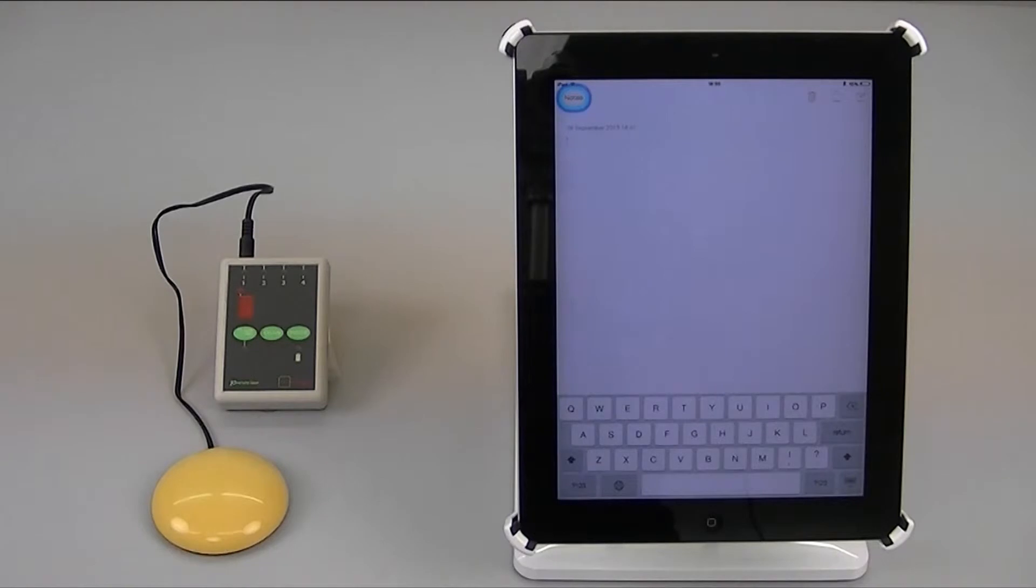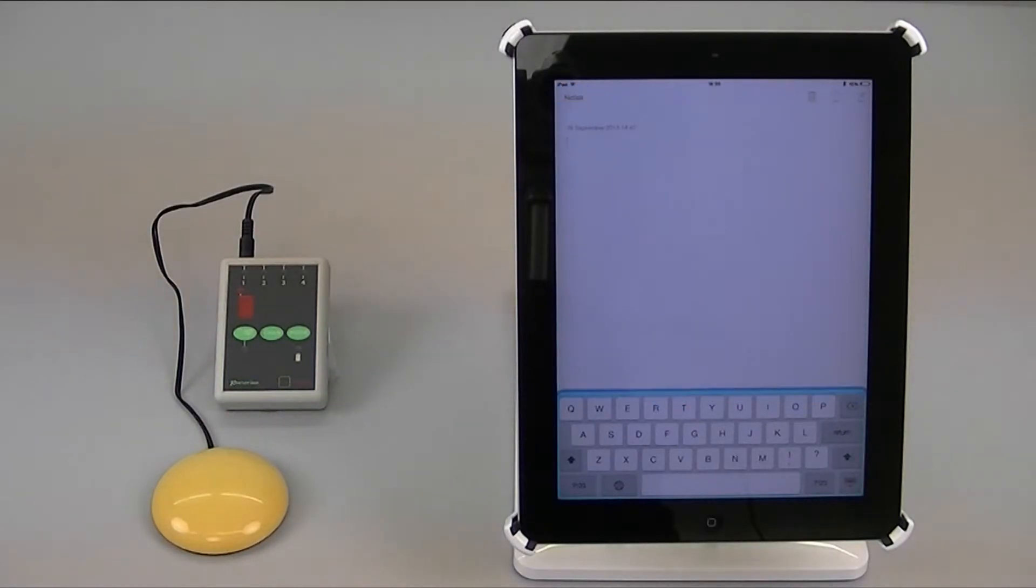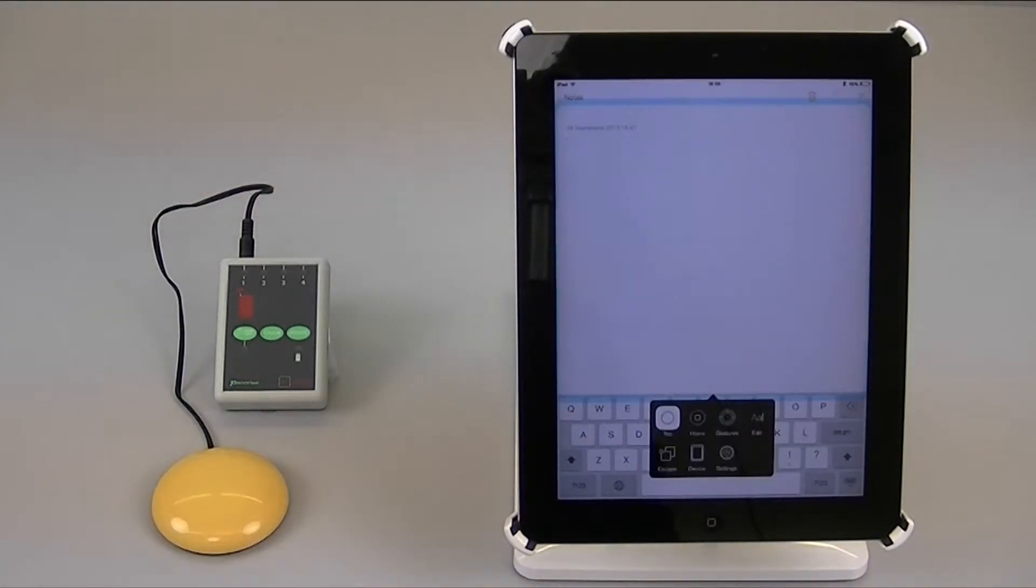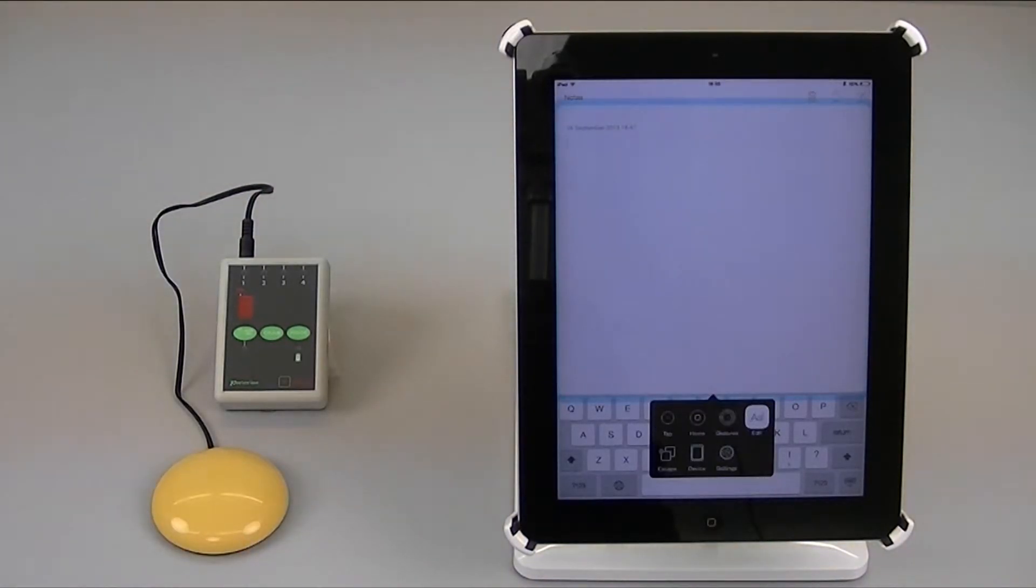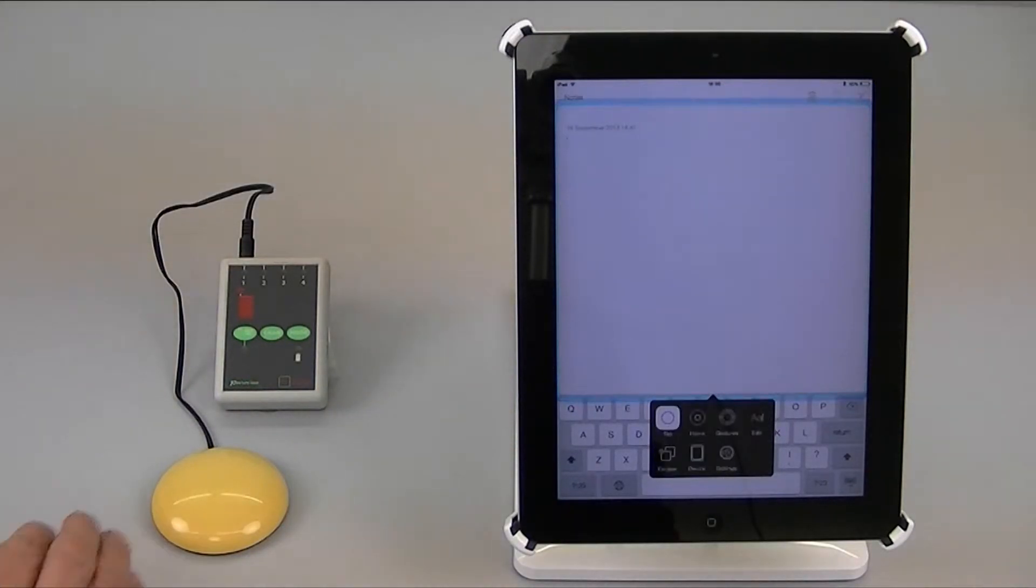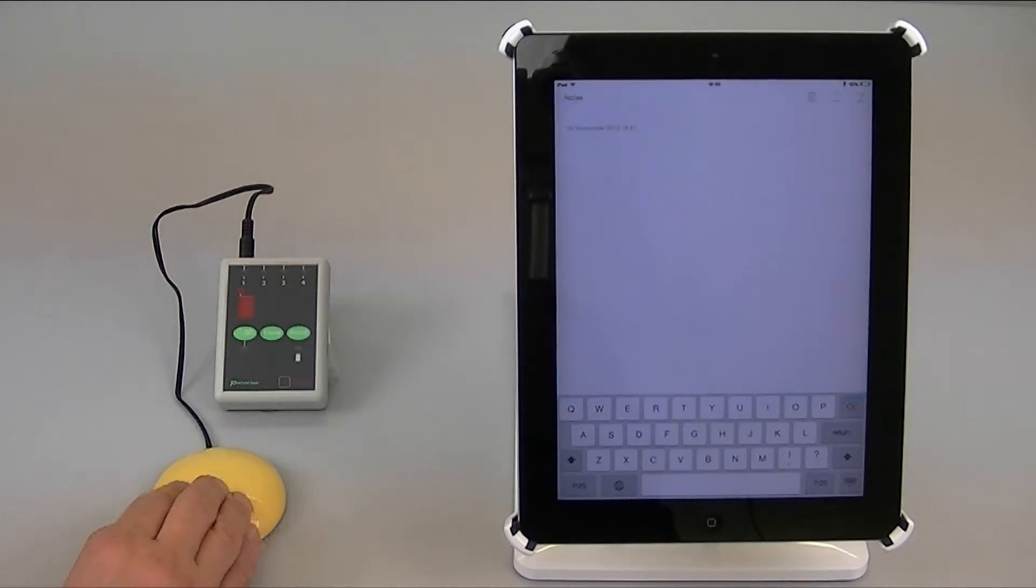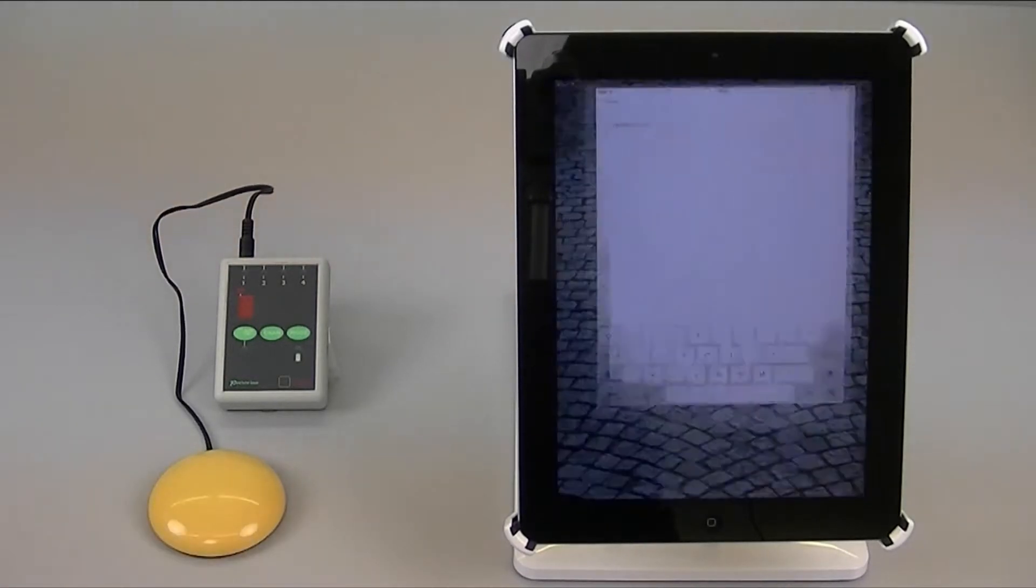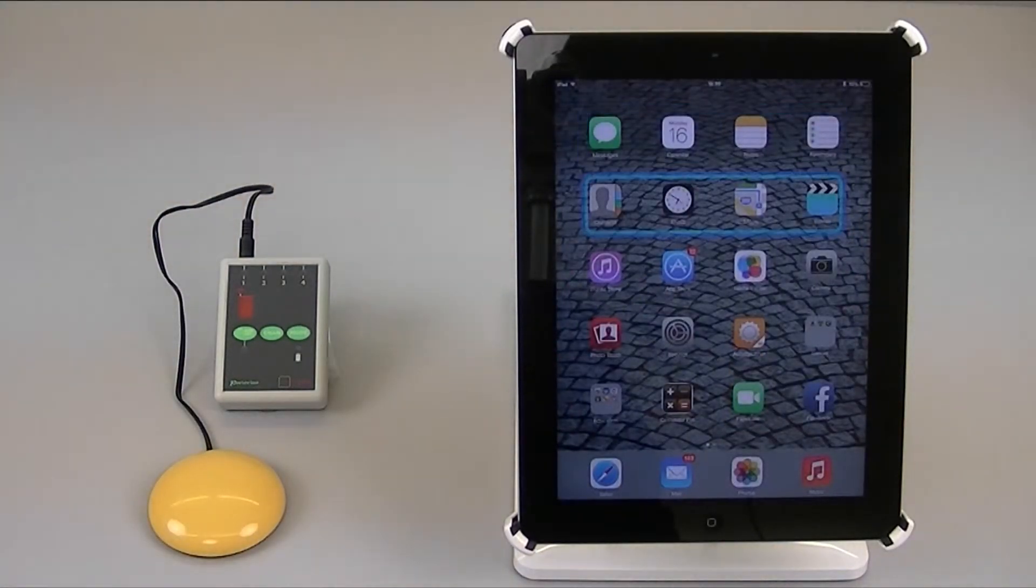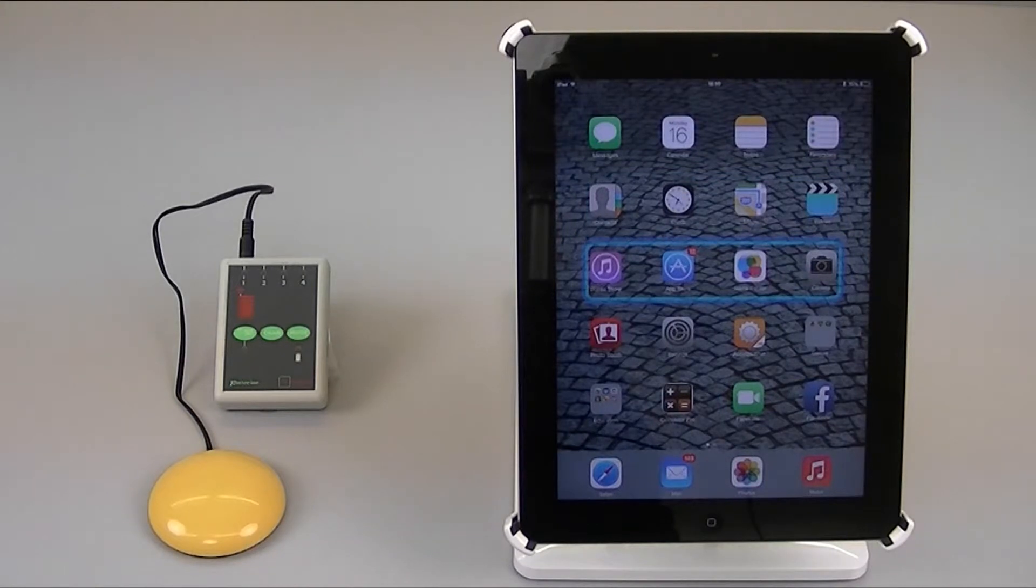Now if I begin the scanning process by pressing the switch and when I'm on the text box, if I double click now you'll see a secondary menu appears. One of the items within that secondary menu is home, it's actually the second item there. If I tap that now it automatically takes me back to the home menu.